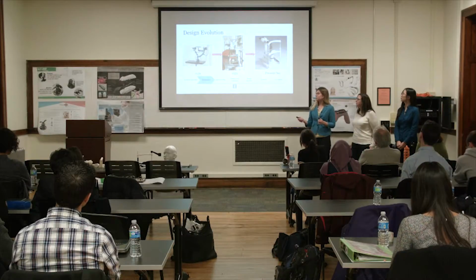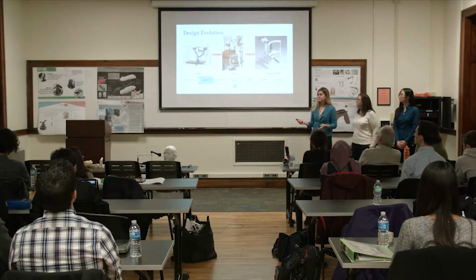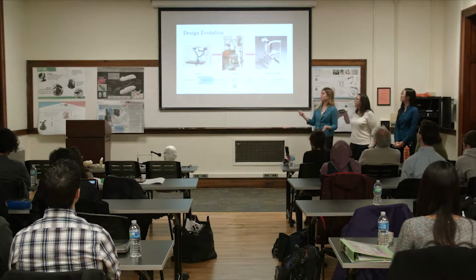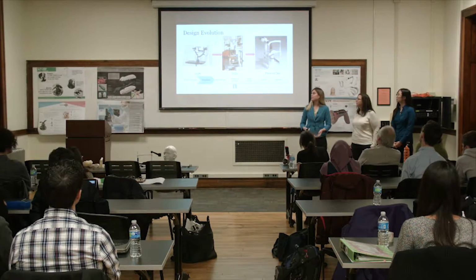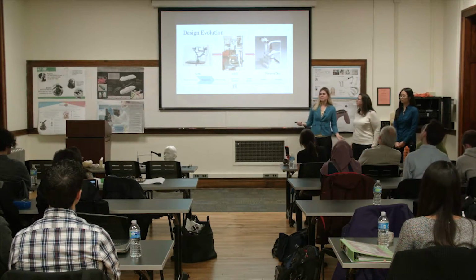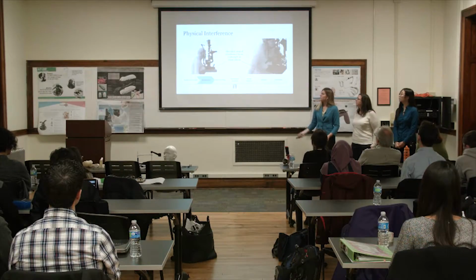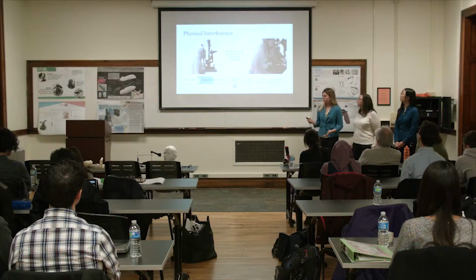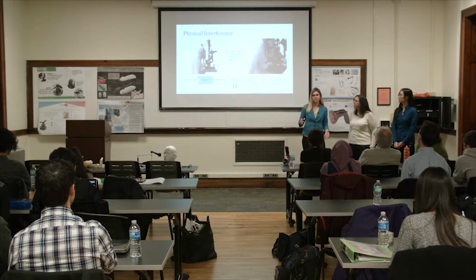As you can see from these pictures, the slit lamp has not changed much since it was first created in the 30s. Actually, the 1959 image is almost exactly what it is now, so not much has been changed. It's been working. However, like I said, it's not comfortable for patients, and I doubt it was very comfortable back then either. So here's another illustration of where the problem is really occurring in these areas. You're being crushed sometimes in there, and even though it's a short examination, it's still uncomfortable.